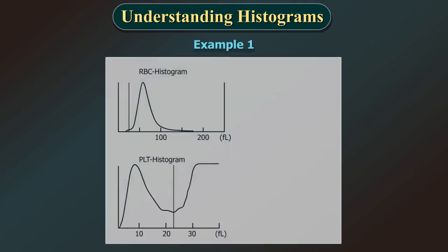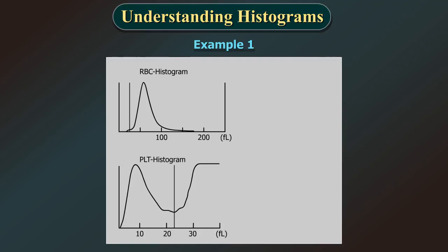Histogram interpretation, case discussion. Let us examine a few examples of histograms to understand the interpretation of some common pathologies. Let us take example 1. Here, the readings are as follows.